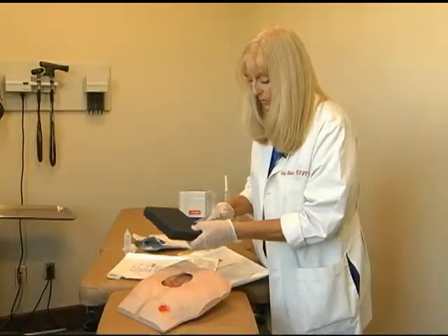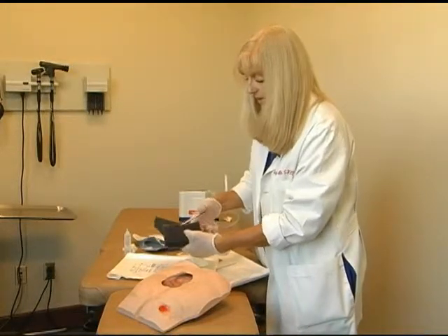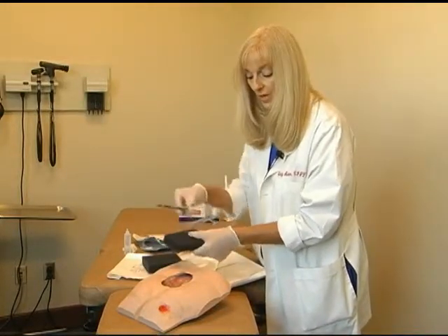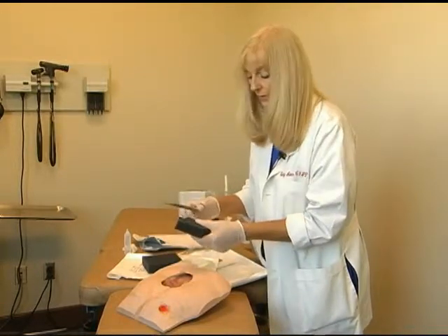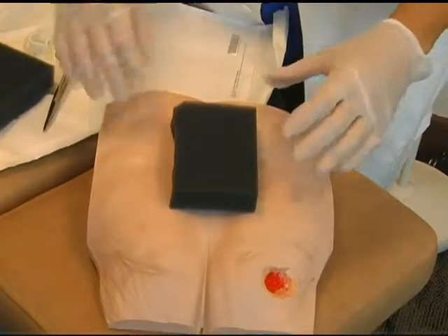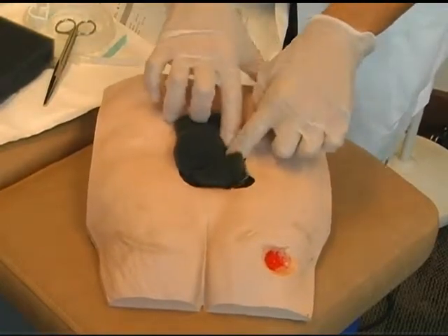For this particular wound, we'll just cut a small section. Try to cut your wound fillers — regardless of whether it's black, white, or cotton — away from the wound surface, so that any residual debris or flakes does not fall down into the wound. Even though the black foam may appear larger than the wound surface currently, the foams are compressed down into the wound surface area.